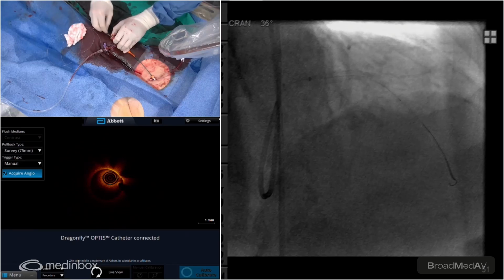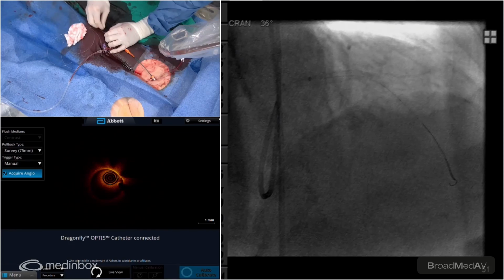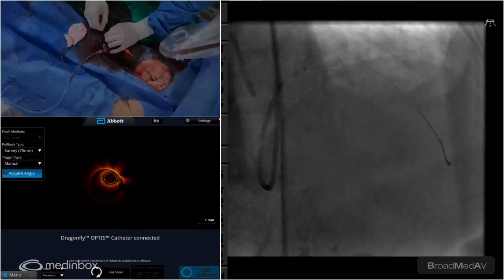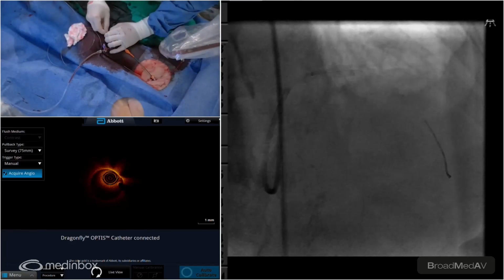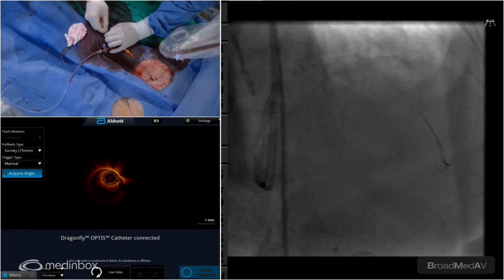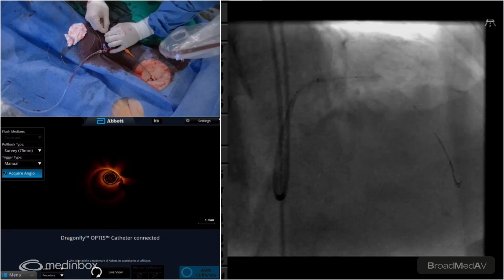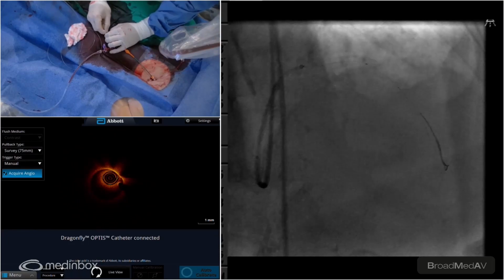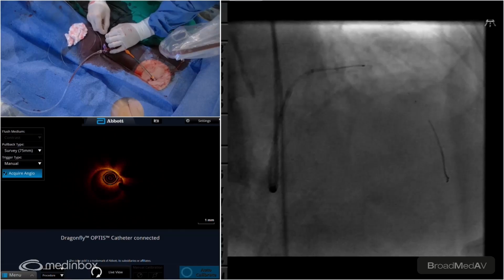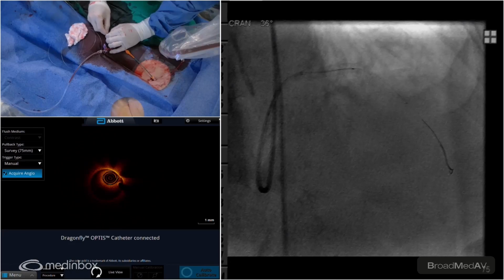I'll give this the origin again. So third time's a charm. See whether the thing makes it in. Perfect. Exactly where we wanted. Perfect. Like butter. I think that's deep enough for us. Absolutely. Just going to pull the guide liner back so it allows us to.